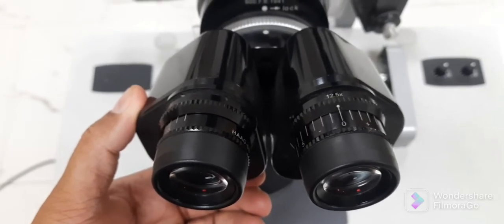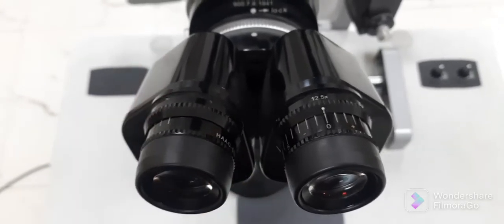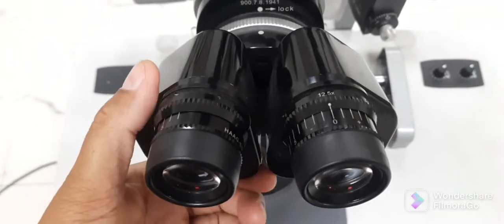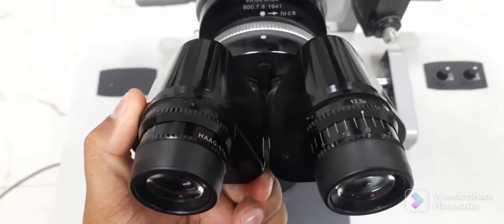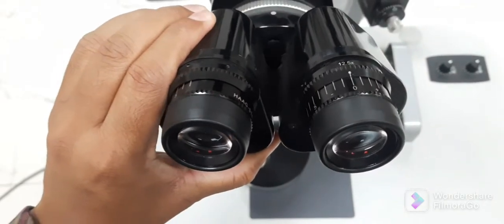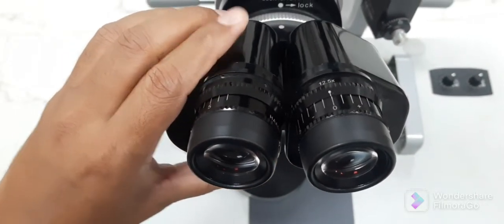Now the next most important step is to adjust the interpupillary distance by rotating these knobs which houses both the eyepiece lens - inward for short pupillary distance and outward for wide IPD or interpupillary distance.